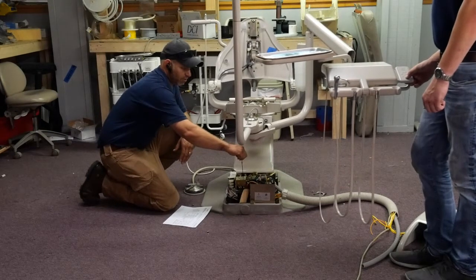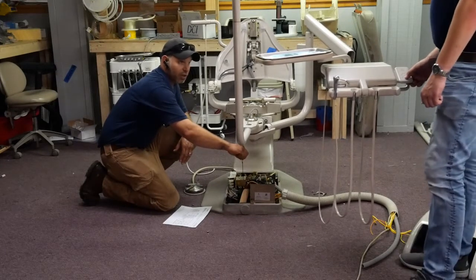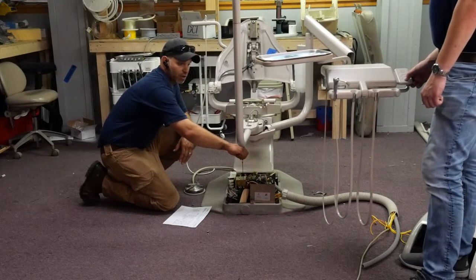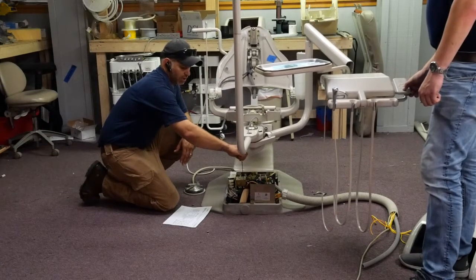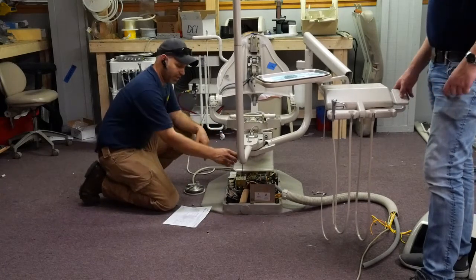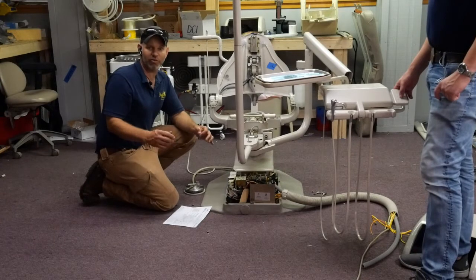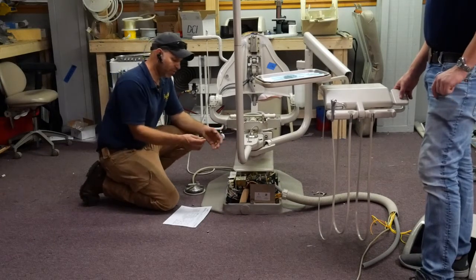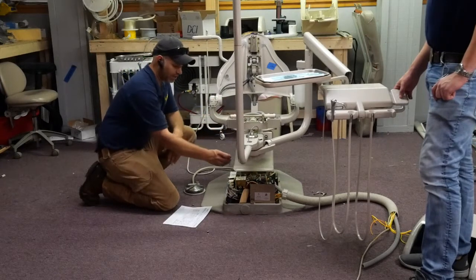Okay, see how I adjusted it? Go ahead and keep it going. I'll rotate that, and we'll gain more speed. Now, a thing to make sure about when you're adjusting this is that you're not over adjusting it so that you create a hazardous situation for yourself or your patient. So that was the base up and down adjustments, and that's on the patient's left-hand side.